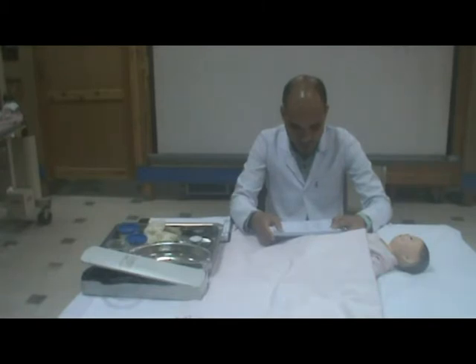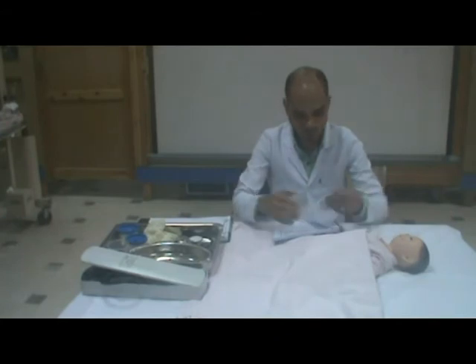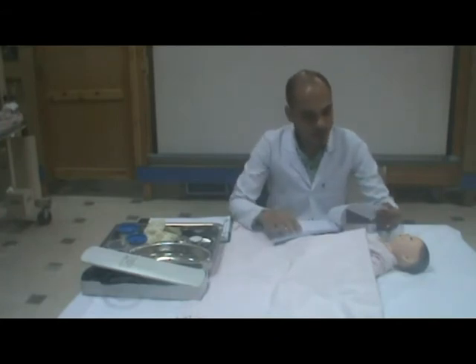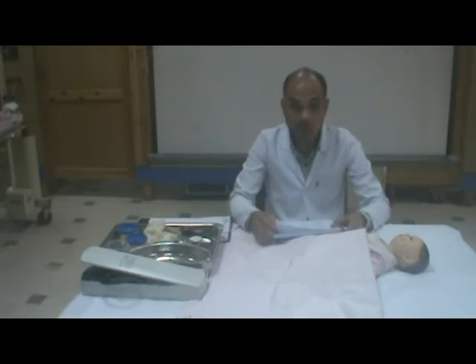Disadvantages: value is readily influenced by ingestion of hot or cold fluids and oxygen therapy. Requires the child's cooperation to keep the mouth closed and not bite the thermometer. Contraindicated if a child has oral surgery or is under 5 years of age. Length of time, 5 minutes. Suitable age, more than 6 years.